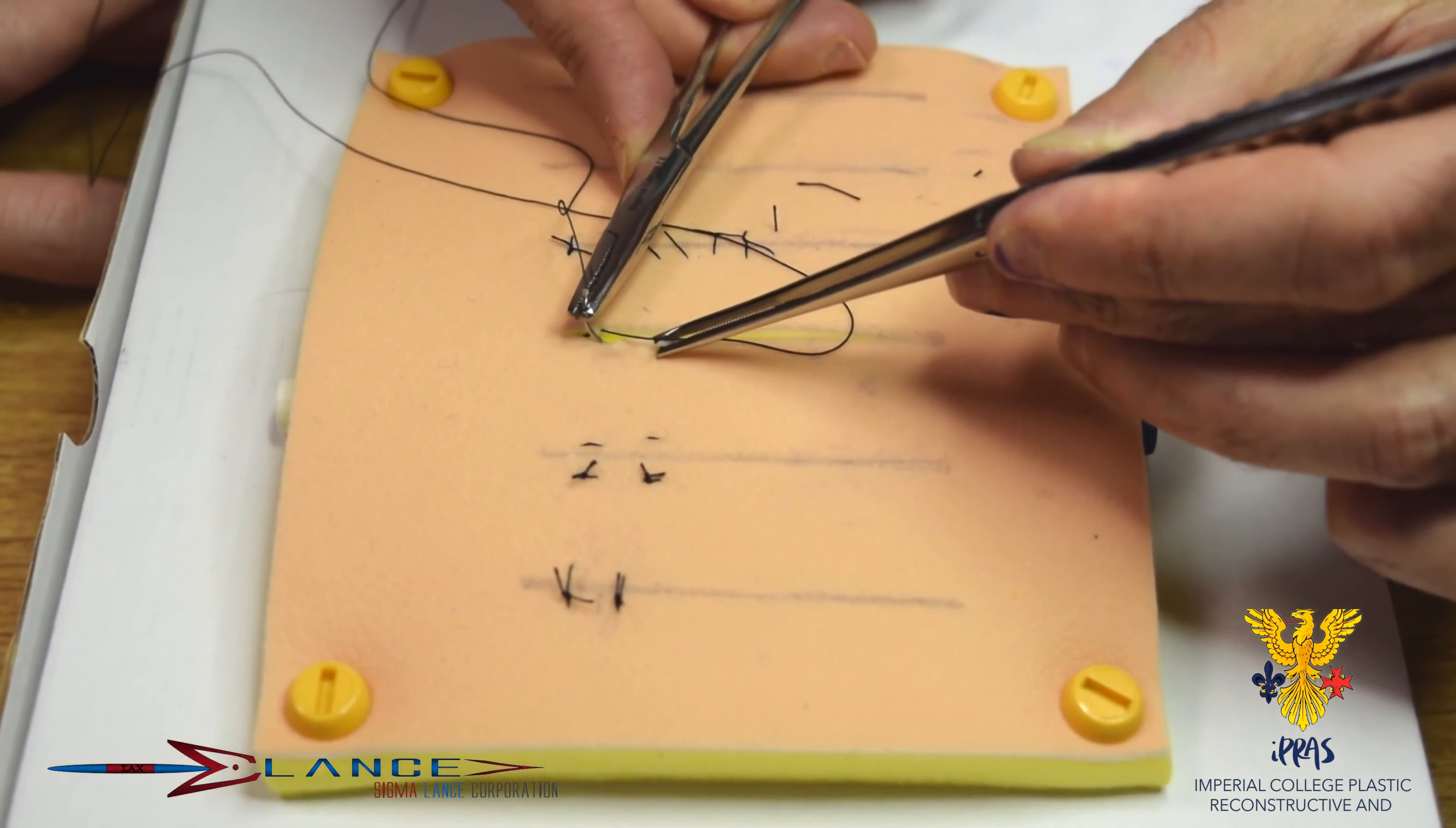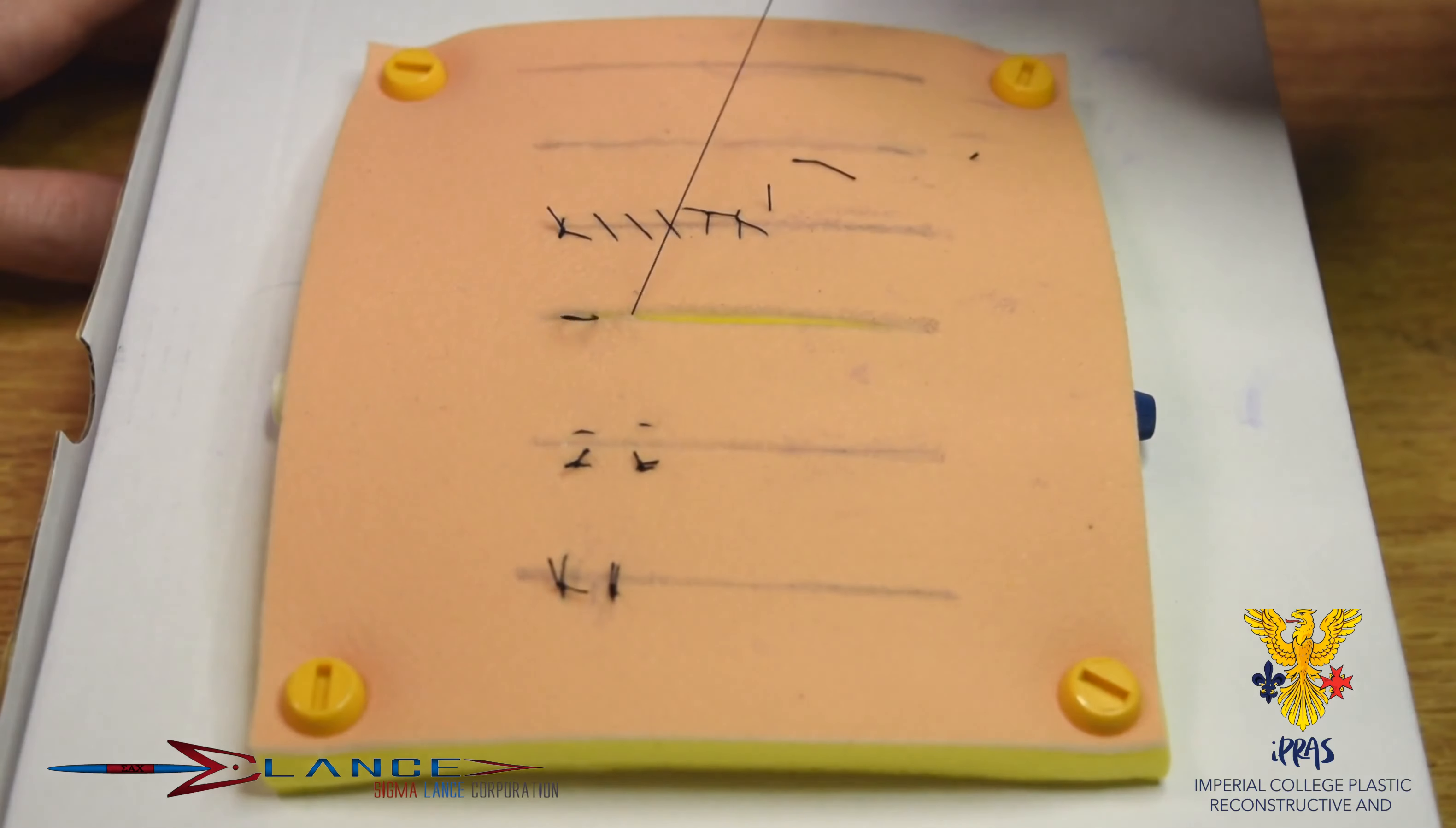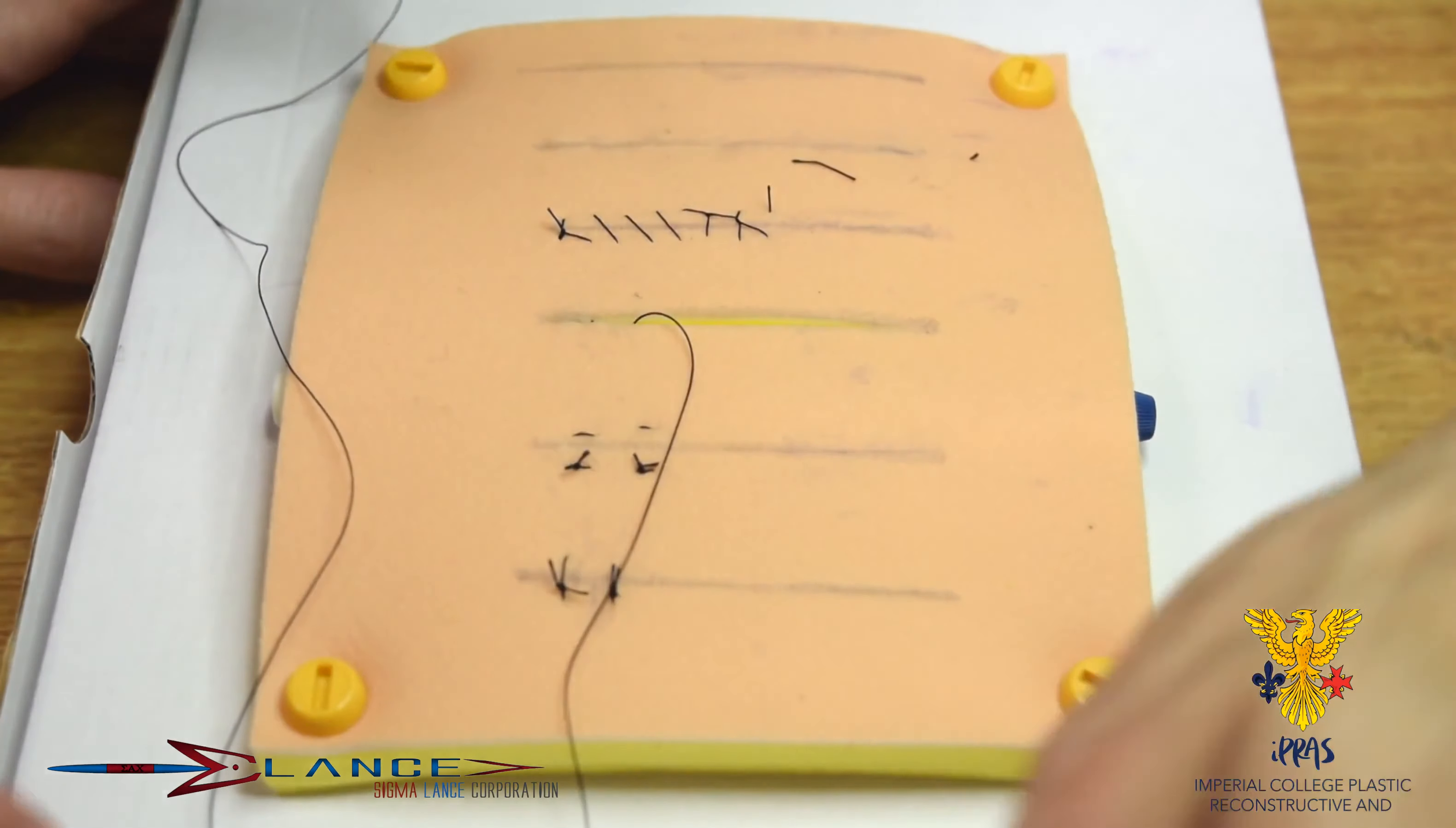And it's a little bit difficult on here because that dermis is very thin. So it's here, so what I don't want to do is to be ahead of that, I want to be behind that suture.